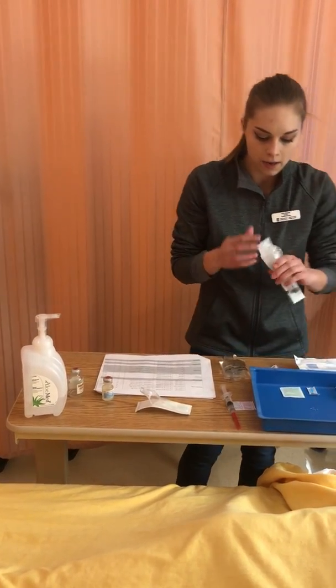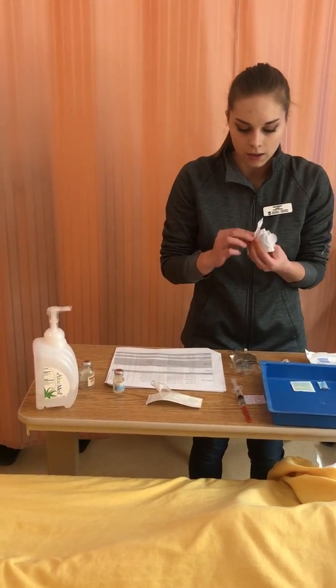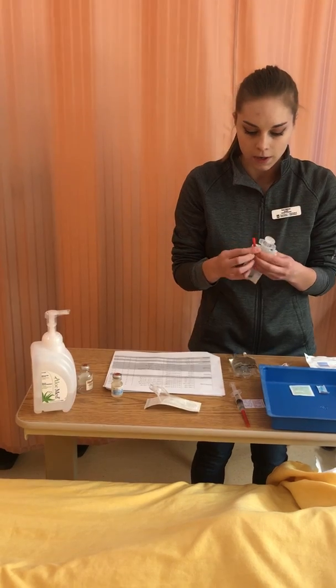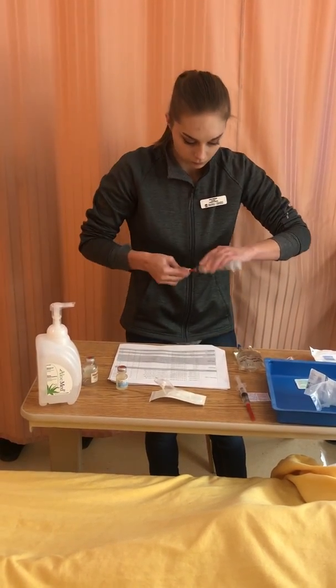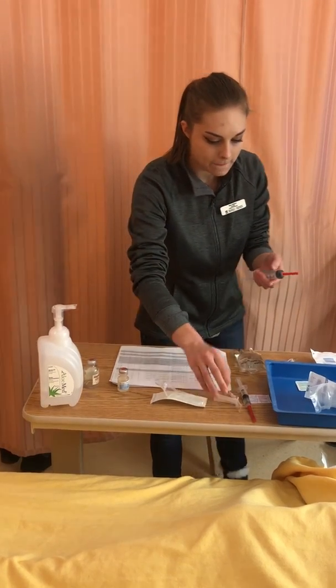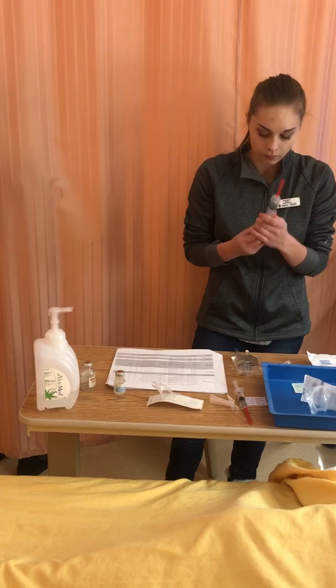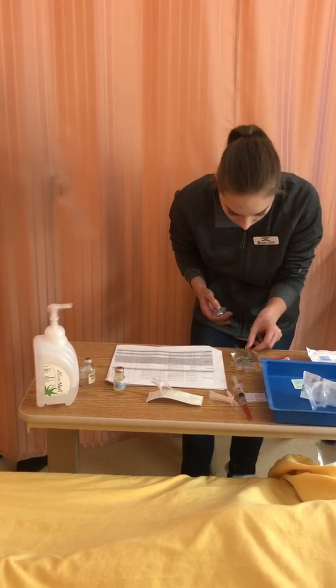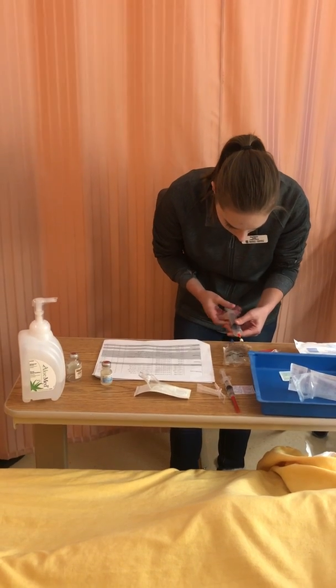I have my 30 ml syringe. So now I'm ready to go, along with my blunt needle. Once I get in, I'm going to do a quick safety check to make sure that there is no equipment on the floor. My patient is not in any form of distress, and that is what I see right now. I'm going to do my hand hygiene.